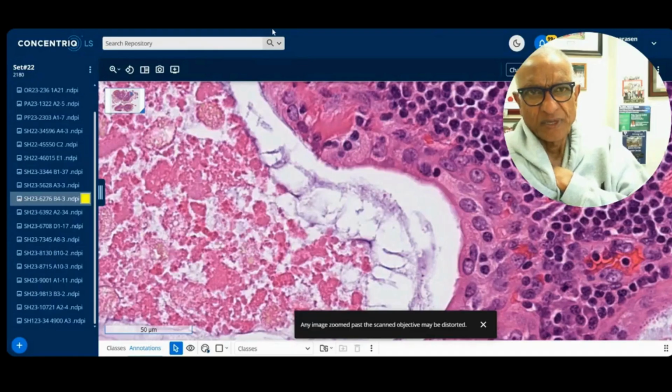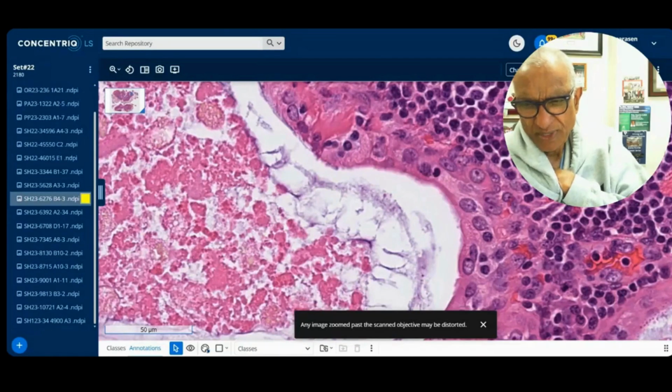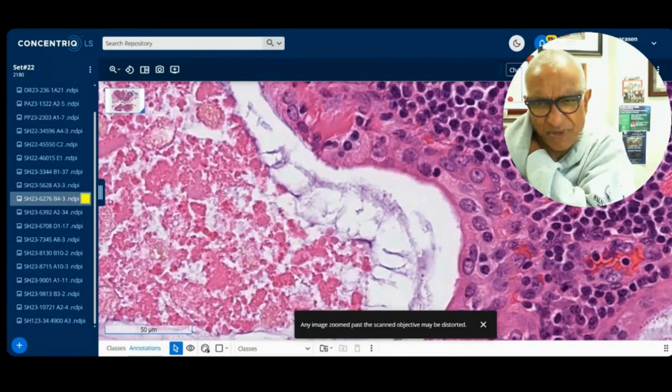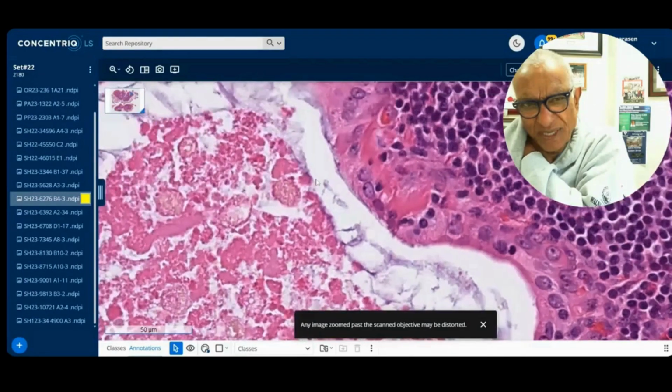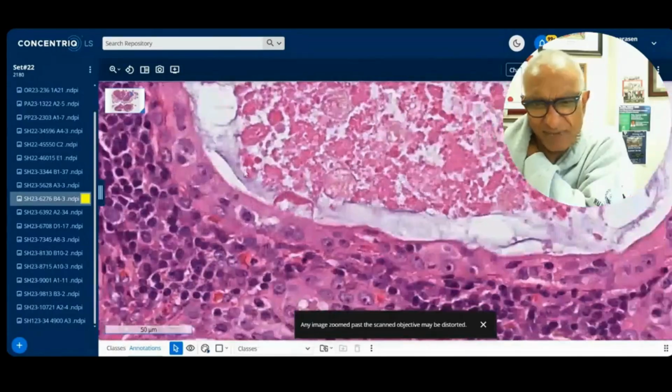Yes, Solomon. Yes, Tiba. Yes, ciliated. No, Omar, what are you thinking about? Are you thinking about metastasis or are you thinking about primary? There's a ciliated HPV-related carcinoma, and what ciliated are you thinking, Omar? Query ciliated. It's a good thought. I'm just curious. I want to know what you're thinking. I'm not in a position to read your mind, so let me know, please.